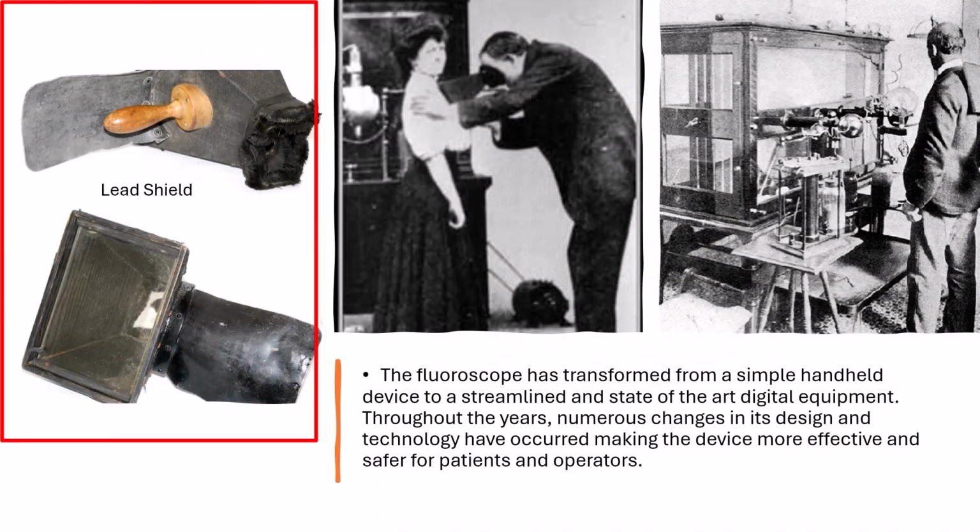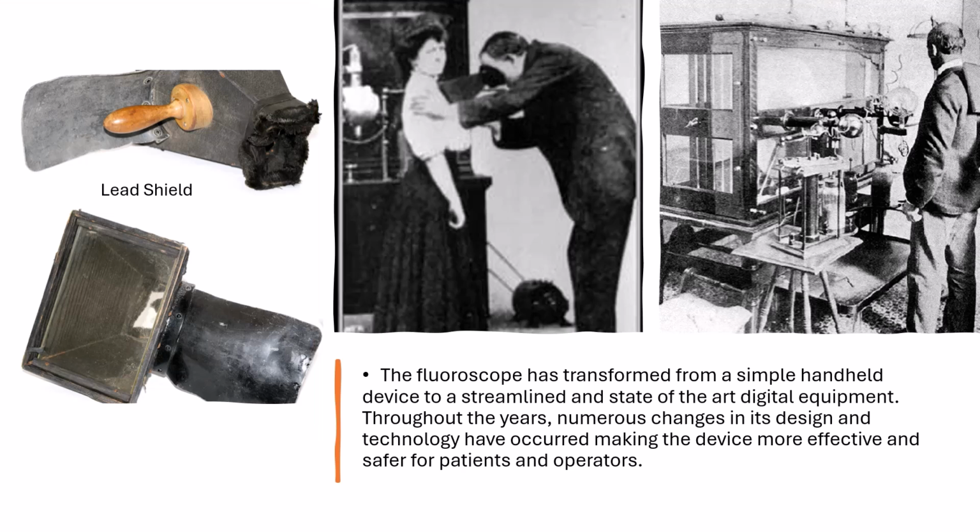The fluoroscope has transformed from a simple handheld device to a streamlined and state-of-the-art digital piece of equipment. Throughout the years, numerous changes in its design and technology have occurred, making the device more effective and safer for patients and operators.